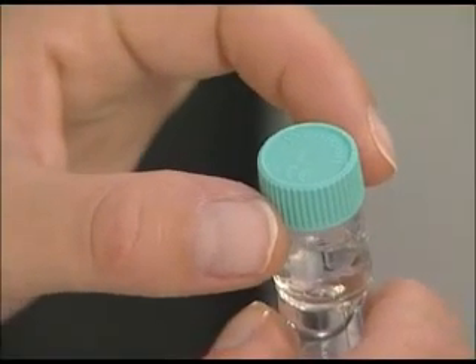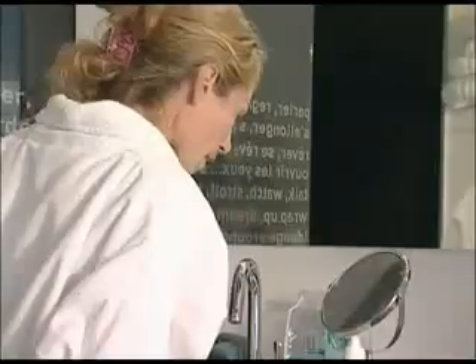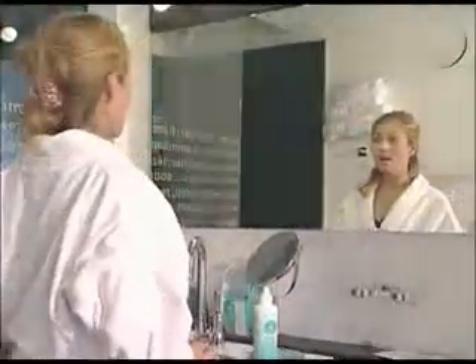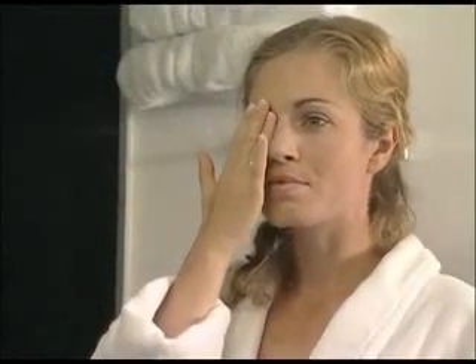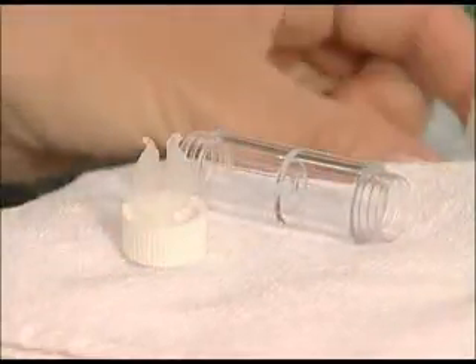Follow the same steps to insert the left lens. If your vision seems blurred, be sure you haven't mixed up the right and left lenses. Empty the case and let it air dry.